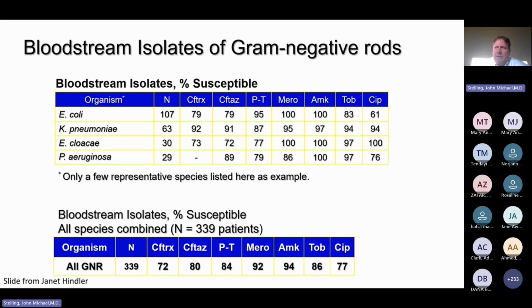What's interesting about this is that you might have a patient with potential sepsis in your emergency room, and it's going to take 2 days to get the antibiotic results. But if there is a positive early gram stain from a urine or a blood, then I know it's a gram-negative rod, so it can be helpful to group the gram-negative rods together so I can make my empiric therapy choices while I wait for the specific species.